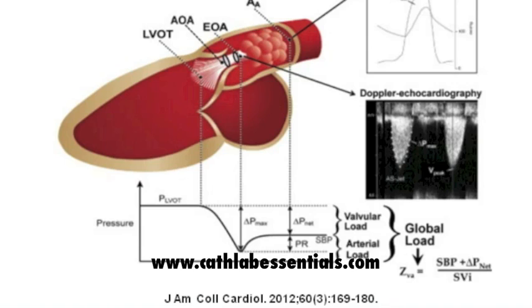Now these features of measured aortic pressure and LV pressure are responsible for differences that are identified between catheterization gradients shown on the upper right and Doppler echocardiographic velocity measurements and gradient calculations shown on the lower right.